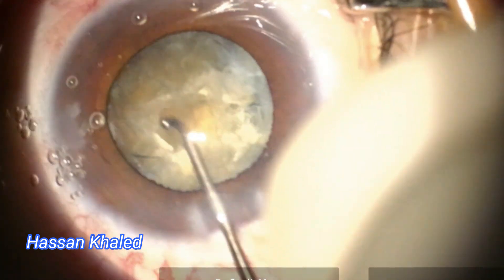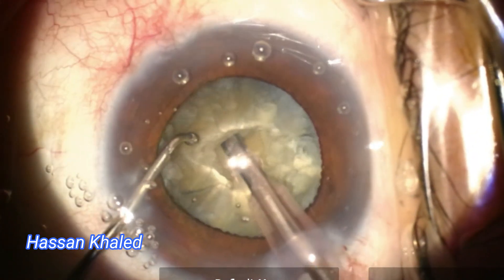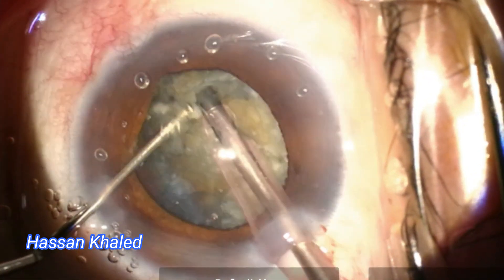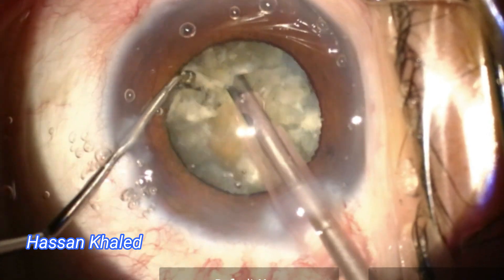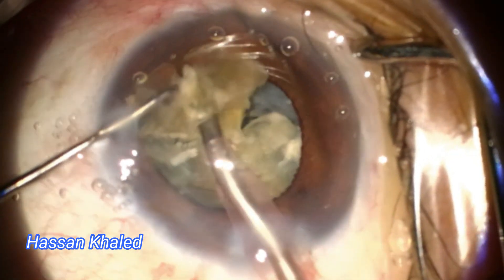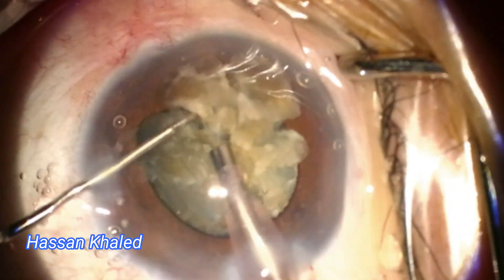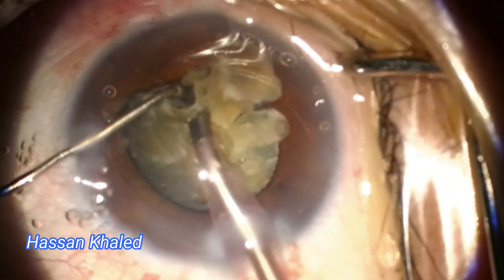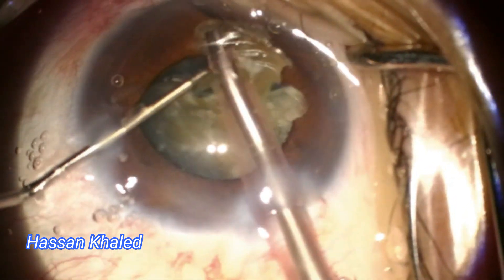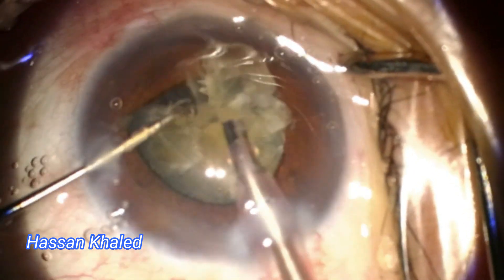Then I inject dispersive OVD and complete the chopping of this dense cataract, holding the nucleus very smoothly. By the second instrument, the chopper — here it is separated, but the separation is not complete because of the posterior plate and the density of this cataract. Trying to chop it into very small fragments, then emulsify each fragment alone at the level of the pupil.